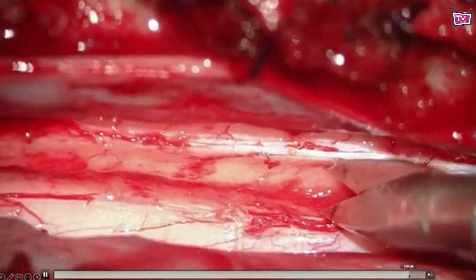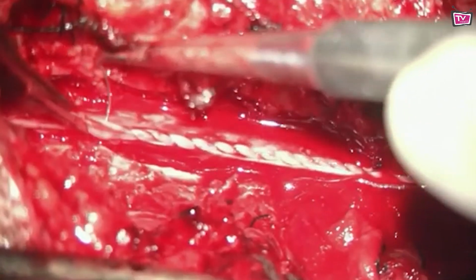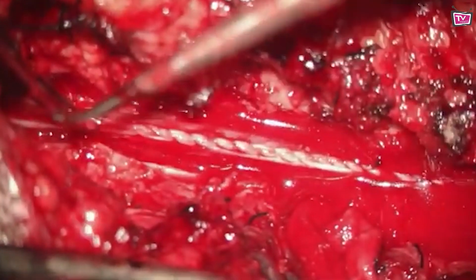So that is how it opens up. We go to that level of depth, and it's basically an avascular plane. Once you know it, then you are there.